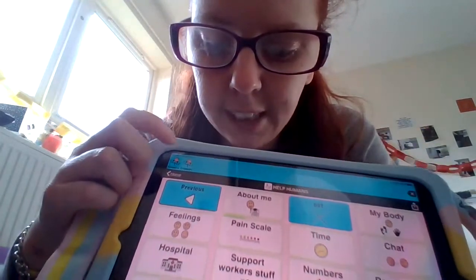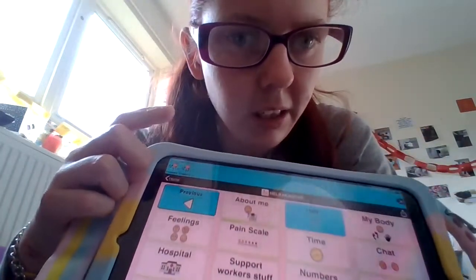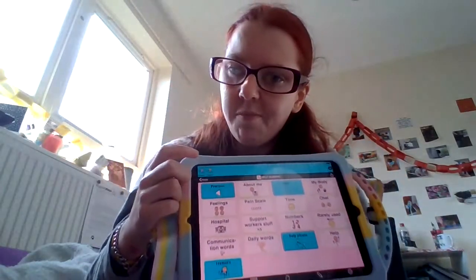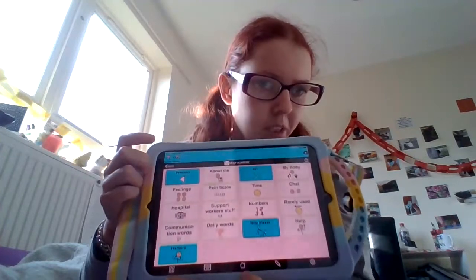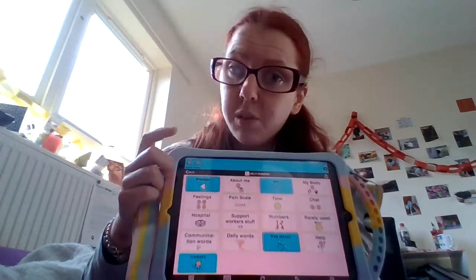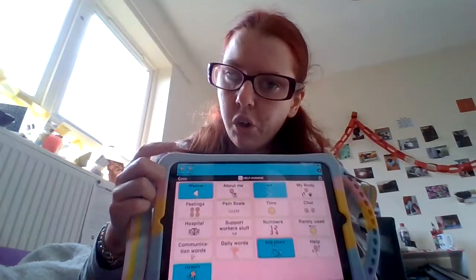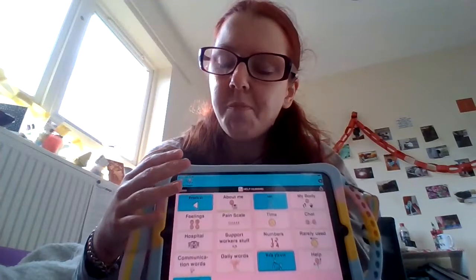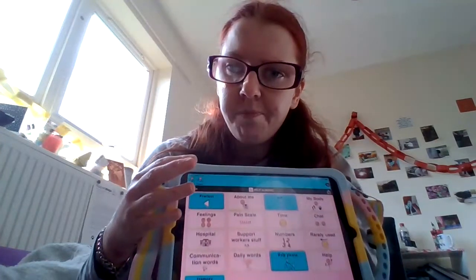And then I will press it and the voice that I selected will say it. Tremors, tremors. I don't know if you heard that, but it should have said tremors because I clicked on it. Tremors, tremors. Like that. And it speaks for me, which would inform whoever's with me, who there isn't anyone with me at the moment, which is why this is okay, that my tremors are starting.